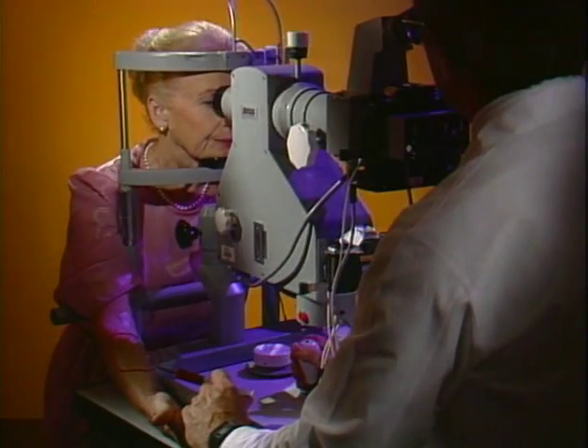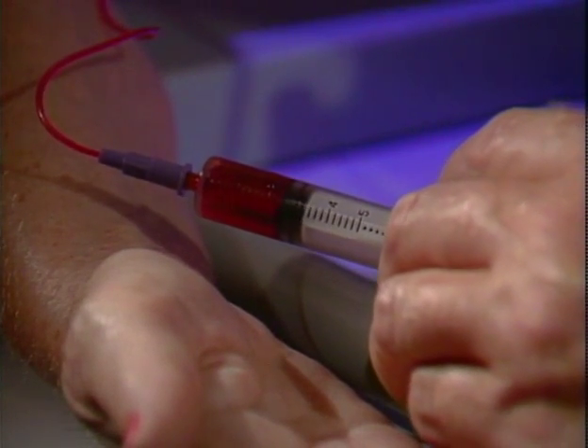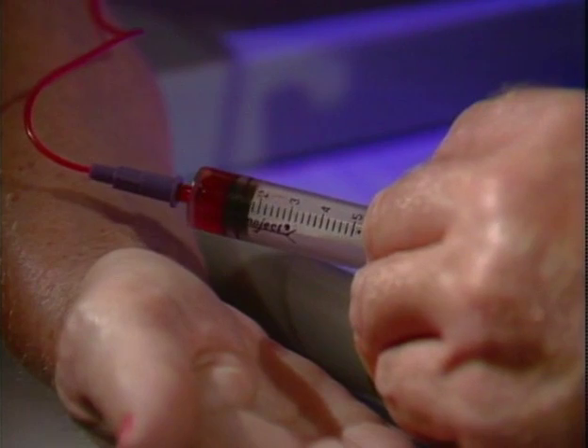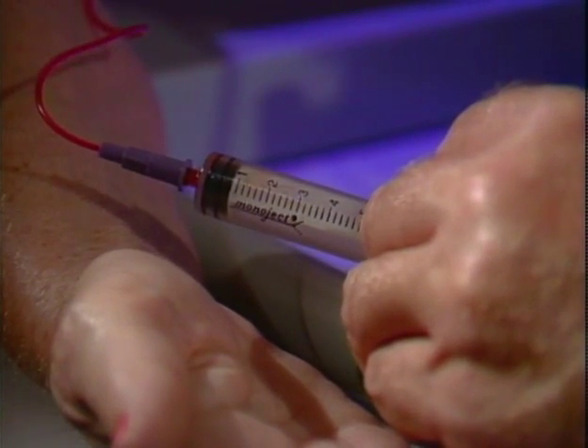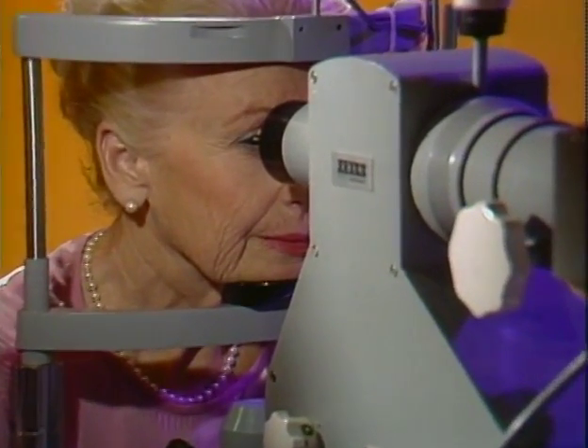You'll be seated at a special camera. A small amount of orange dye will be injected into a vein in your arm using a tiny needle — it feels about the same as having blood drawn. Then a series of flash pictures will be taken of both eyes.